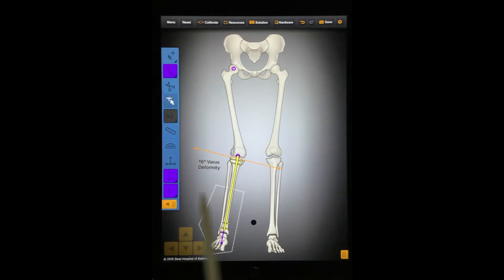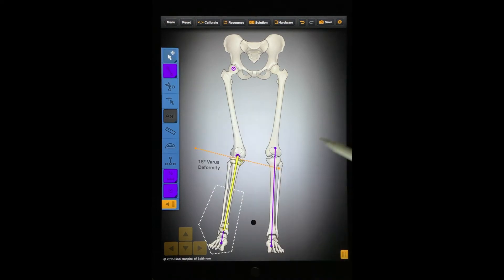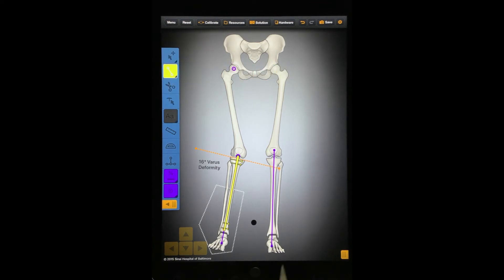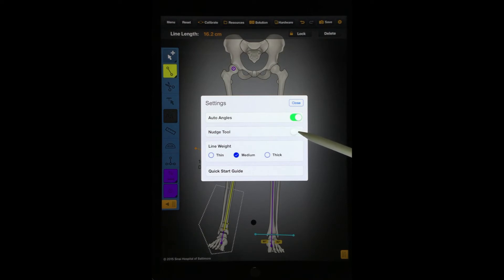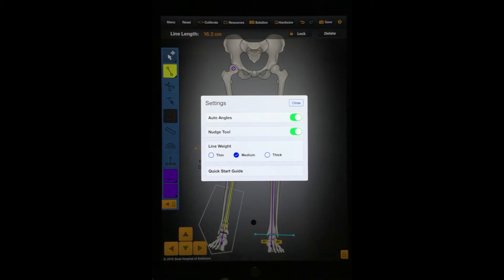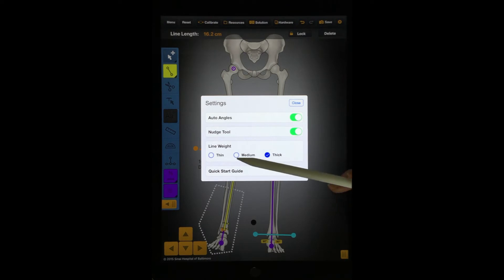Bear with me while I draw the distal tibial planning lines for demonstration purposes. Now let's look at the Settings tools. When the Nudge tool is on, four small arrow buttons will appear in the bottom left of the screen that allows you to move selected elements in small increments. This tool can be shown or hidden. With the Thickness tool, you can choose for your lines to be thin, medium, or thick. Turn on Thick lines when you are giving a presentation using Bone Ninja and need the audience to be able to see your work.